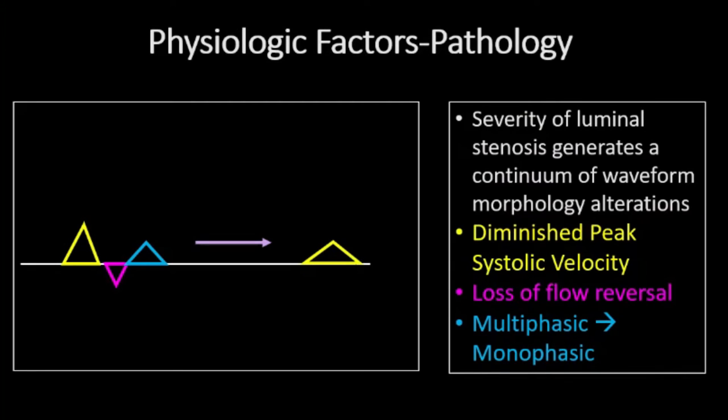In arterial pathologic states, the severity of luminal stenosis will result in a continuum of waveform morphology alterations. Diminished peak systolic velocity, often with sloping of the upstroke, loss of the normal early diastolic flow reversal, and then full transition to a low amplitude monophasic waveform can be expected.